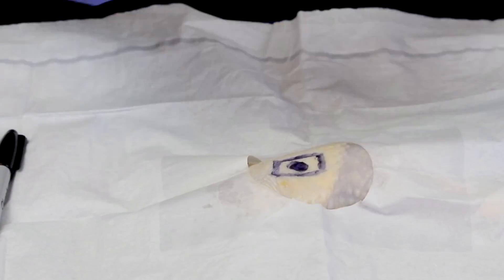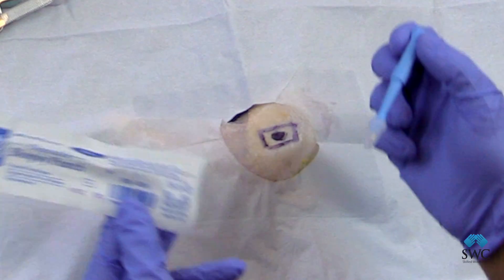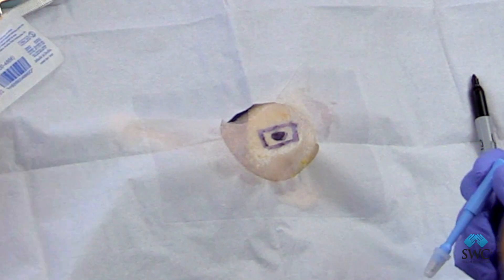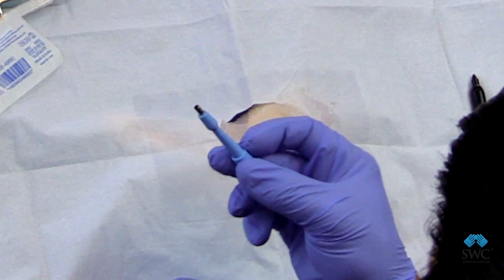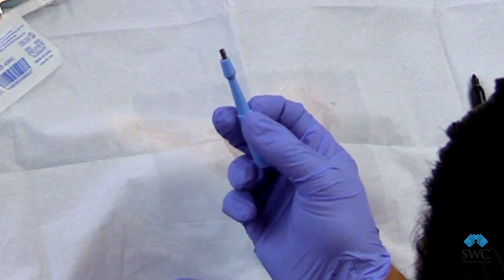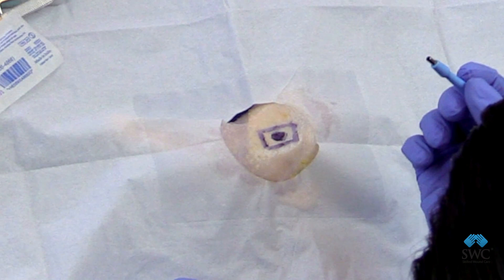Then you want to take the disposable biopsy punch tool. You can look at this one right here. It has a three millimeter head and this is what we will be using.